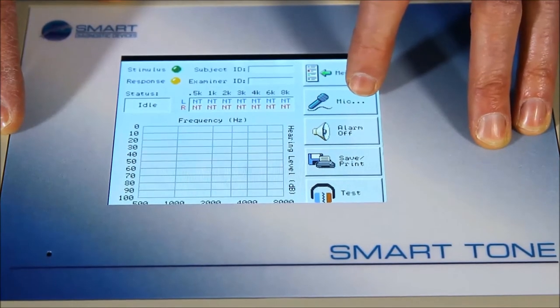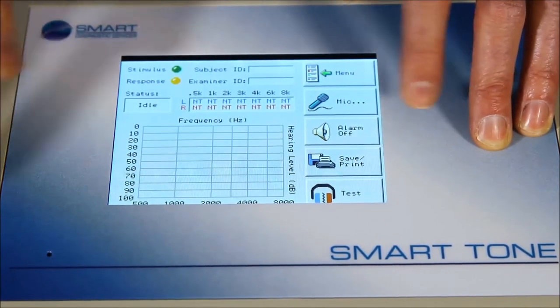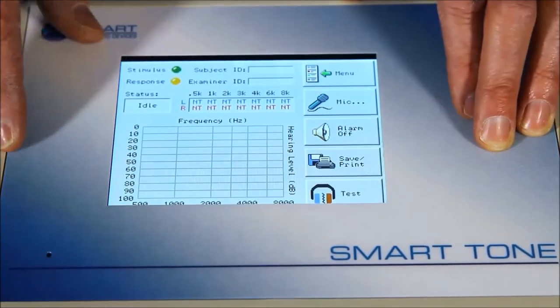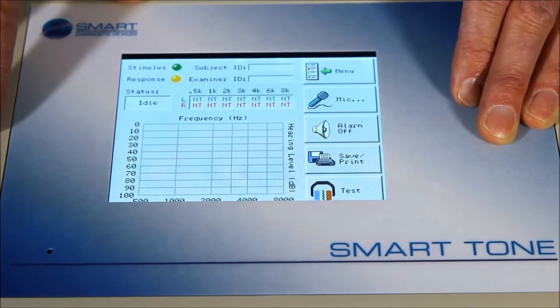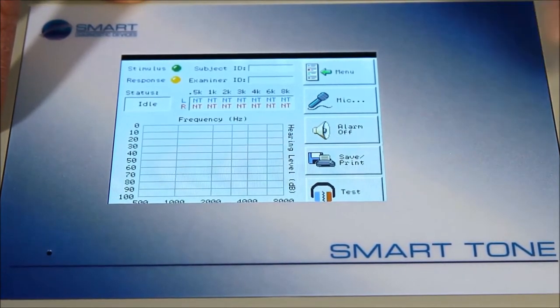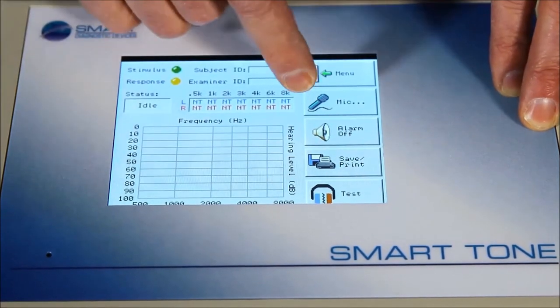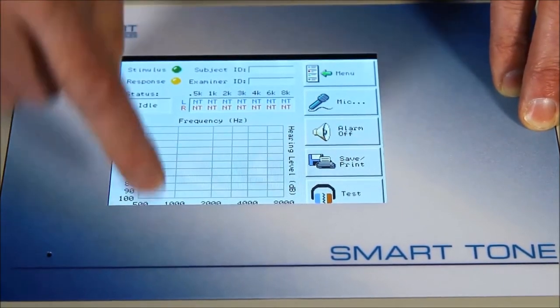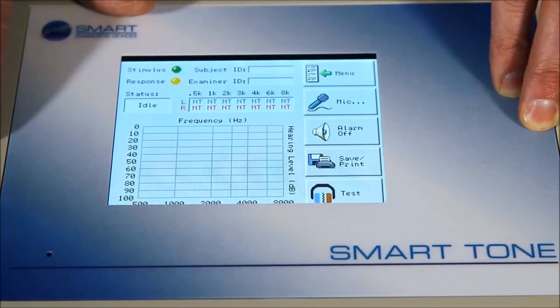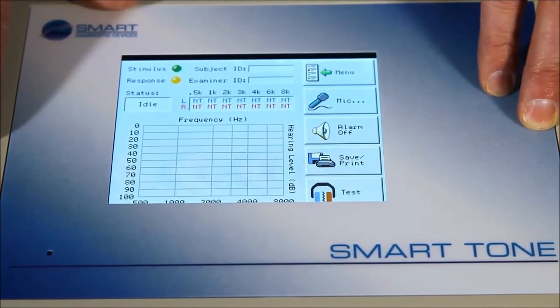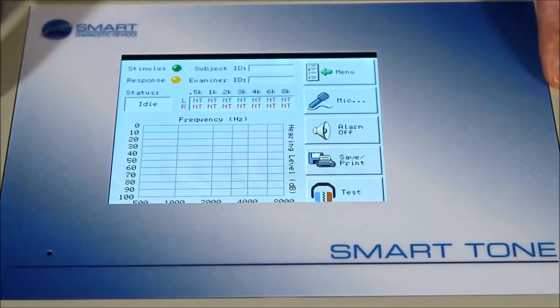We also have a mic button, second button down here. That gives you the ability to use the talk-over feature of the device. If someone's in a sound booth and connected to inside the sound booth, you can push the talk microphone button and you create a talk-over scenario where the person can hear you, maybe re-explaining the test and how it should be taken through the actual headset that they're wearing.